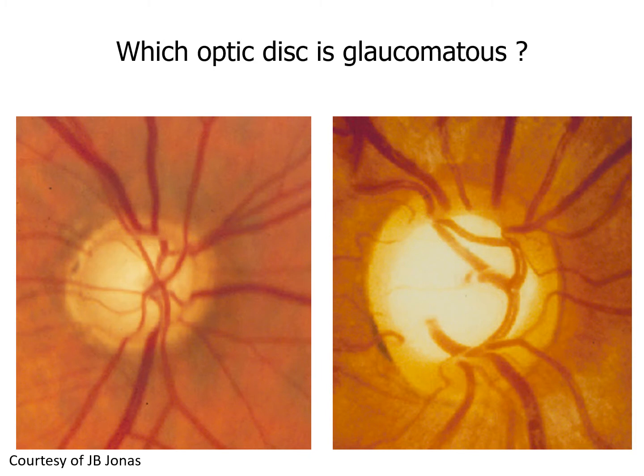which is glaucomatous. And again, you have to observe the vessels of the optic disc where they change direction, and we can observe that this small disc has a very thin rim. On the other hand, this large disc has a rim always present in all the sectors.